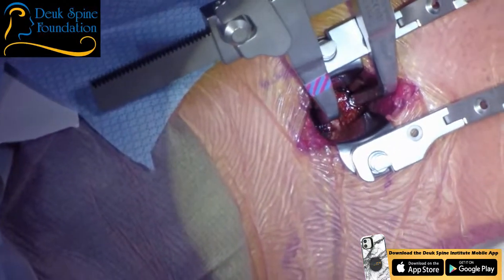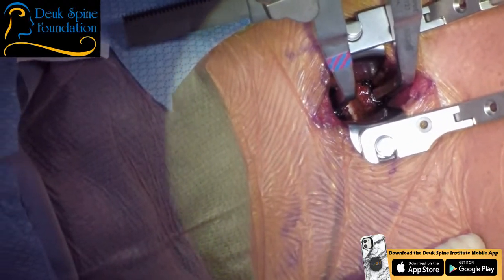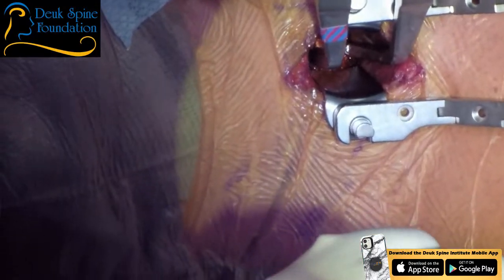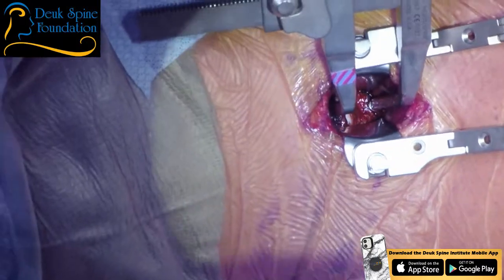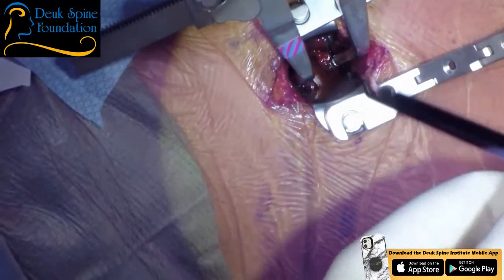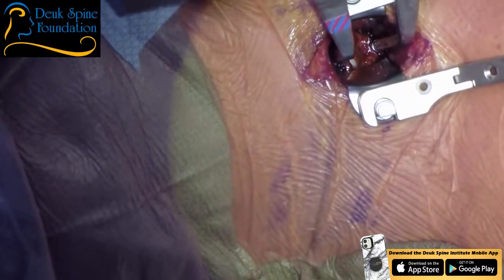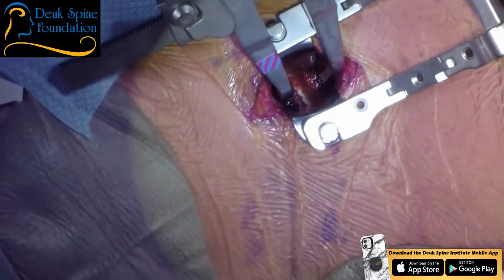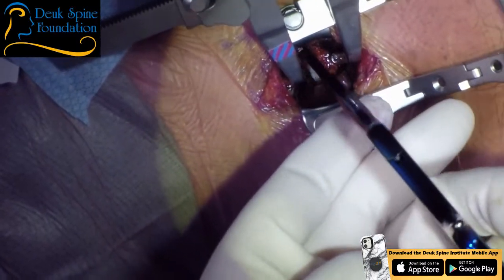All right. At this point, I want to drop the table all the way, and I'm going to bring that scope in. So folks, you're in for a treat. If you think this surgeon's view is exciting and interesting and fun, wait till you get to the next view, which is the microscope. The microscope we use is a $200,000 microscope just for doing basically ACDFs and microdiscectomies. And most hospitals don't even have this kind of a microscope available for their surgeons. A lot of surgeons do these surgeries without a microscope, and it's dangerous if you do it without a microscope, and you're not going to get the same effect.